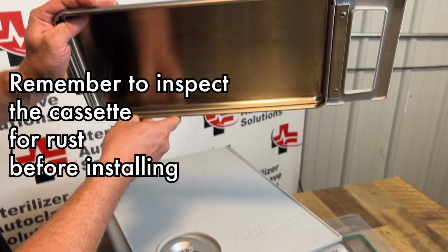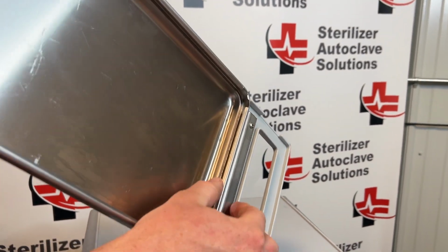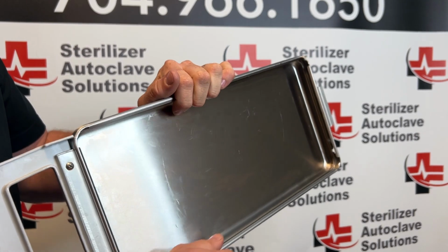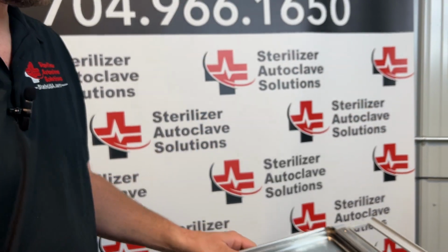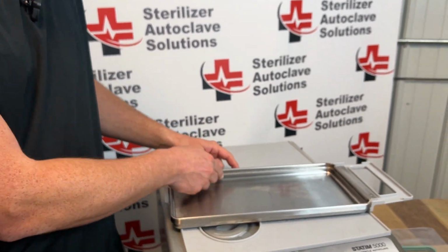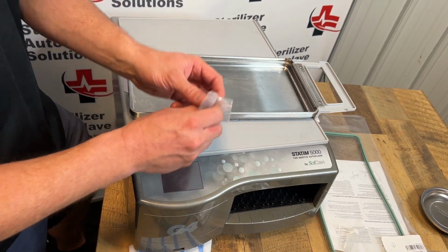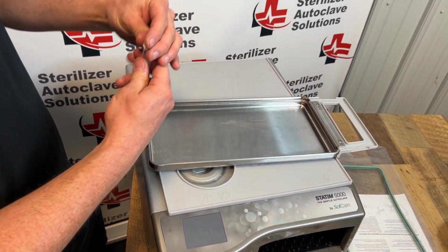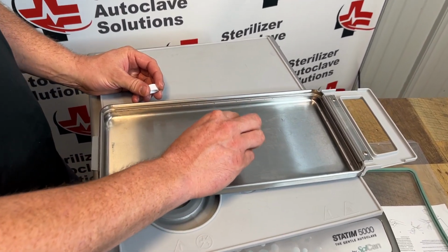We want to inspect and make sure there is no rust or anything inside the cassette that could cause leaks. This one looks in really good condition. If you do have rust, you can use Scotch-Brite or Barkeeper's Friend or anything non-abrasive to clean that up. Next, what we're going to do is take our new seal with the provided lubricant, and you only want to pour about half the vial into the center of the tray.